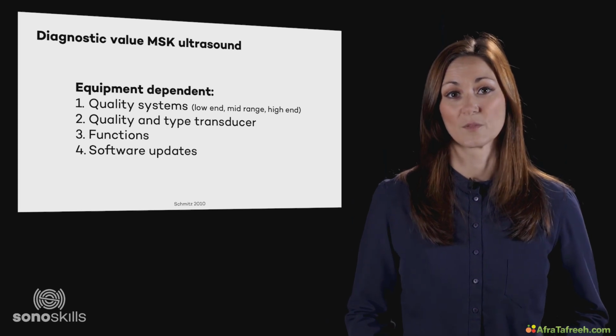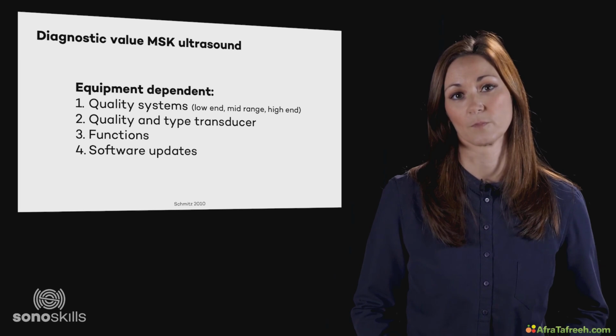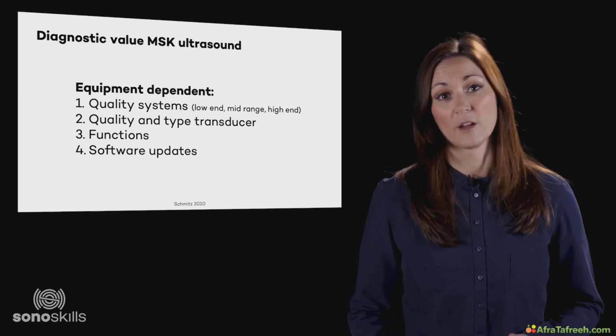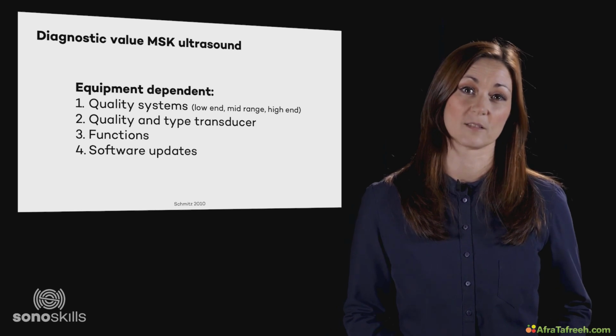We always suggest to first do a course in musculoskeletal ultrasound before buying an ultrasound system. Then you will learn much better what ultrasound is about, what kinds of quality there are, if you like it or not, and you know exactly what suits you and your practice the best.